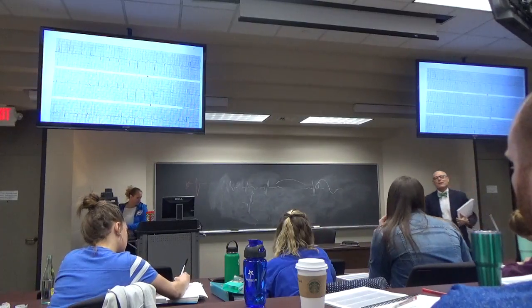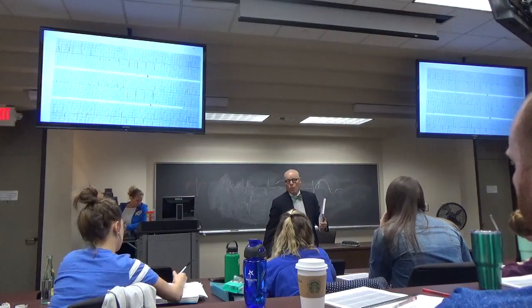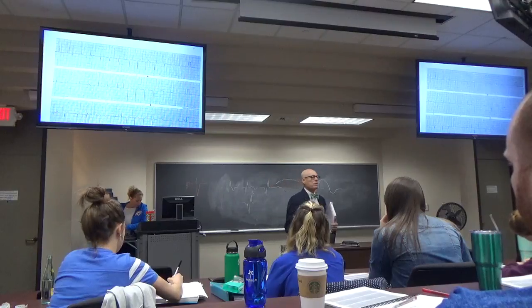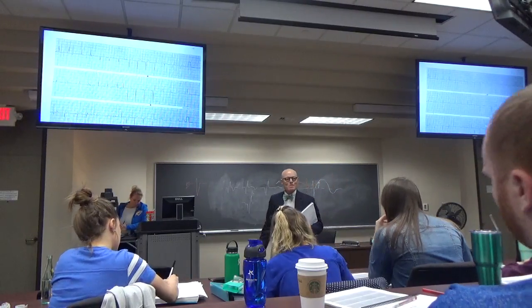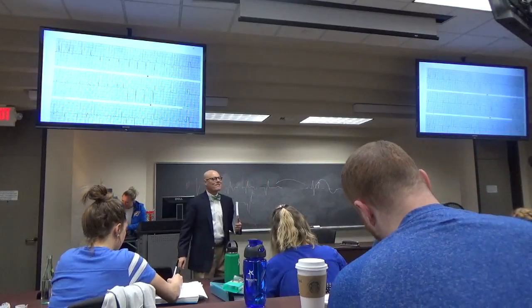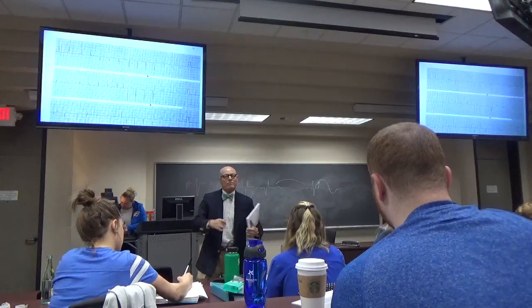Is the criteria for left and right atrial enlargement the same? No. The criteria for right atrial enlargement is a tall P wave in lead 2. Well, 2 or 3.